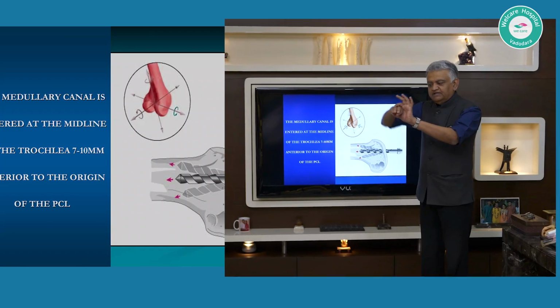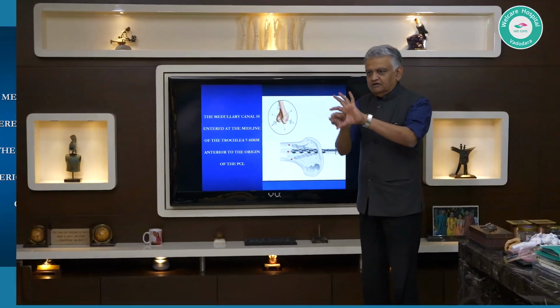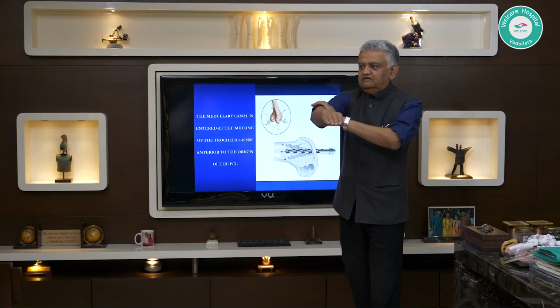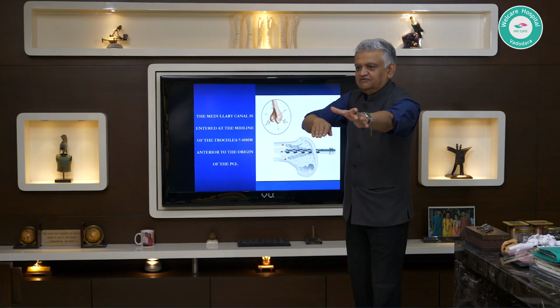But if I have in the early stages done a toggle like this and made it a little bit larger, now I have the ability to modulate my progress of my instrument as it inserts itself further.